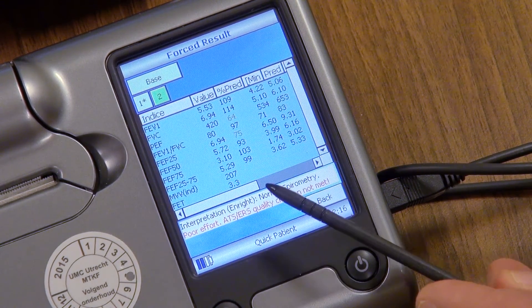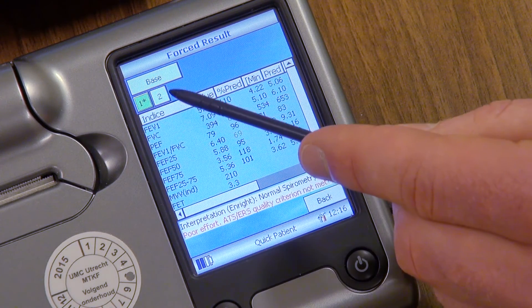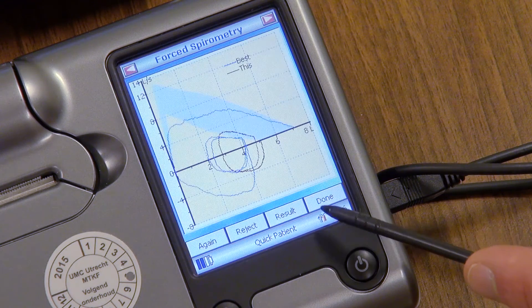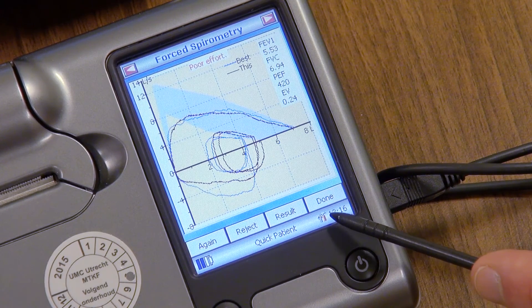Here, you will be able to review the results from all the tests you have done. Finally, if the testing is complete, you can press done.